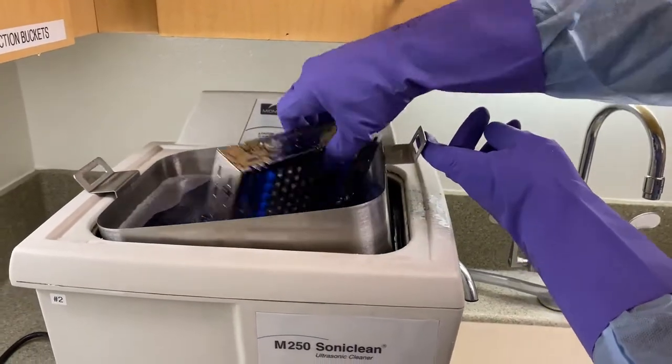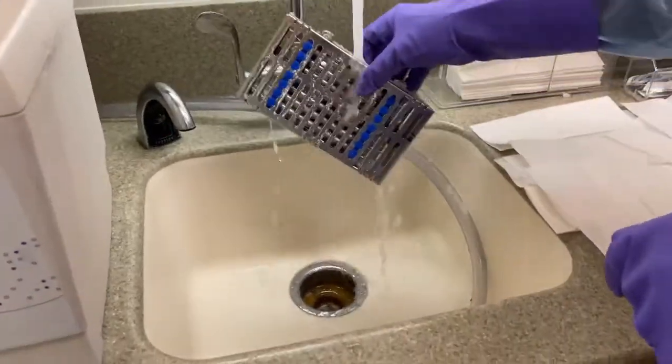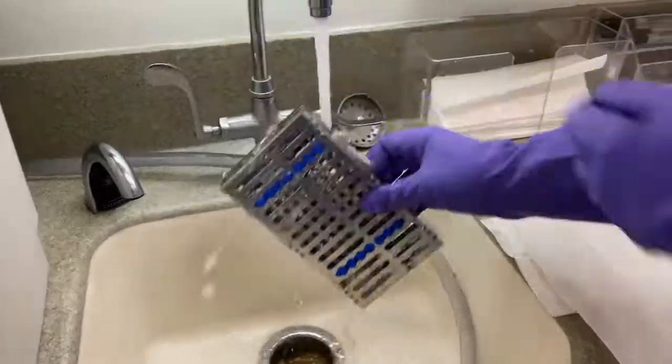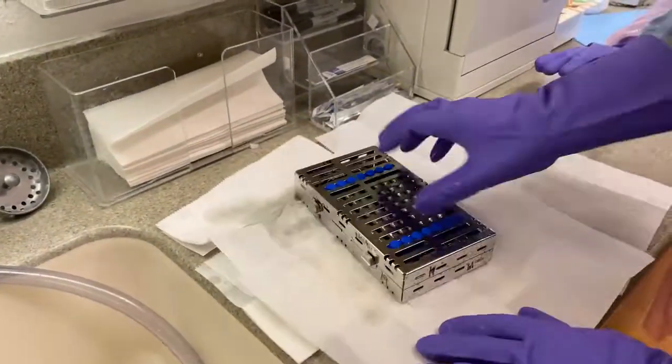After the cycle of 20 minutes is completed, lift the holder and grab the cassette. Wash with water until all of the solution is washed off. Dry up the cassette with paper towels.